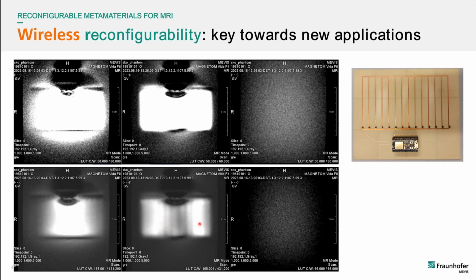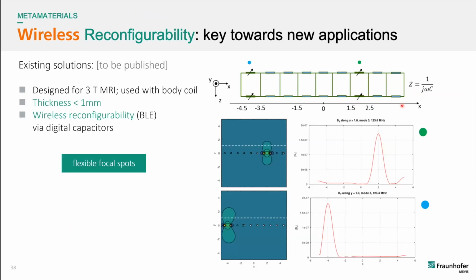getting depicted in the phantom. And by being able to have more of those elements in place, you are able to actually get an individual stripe image, for example. So you can get resonances where you only have those stripes. You can just reorient it in the way and combine it however you like.